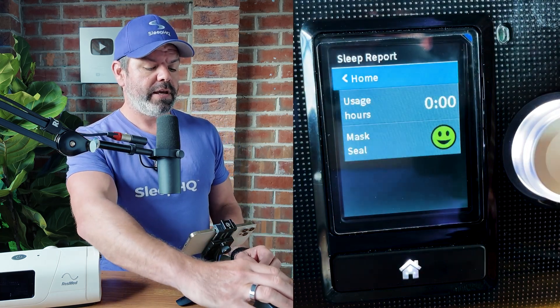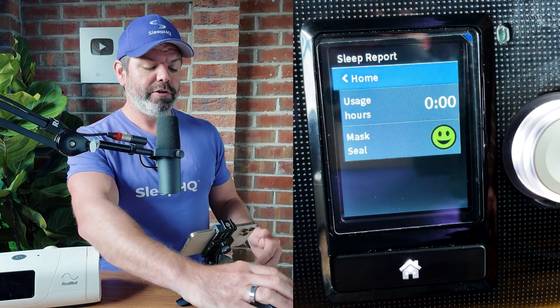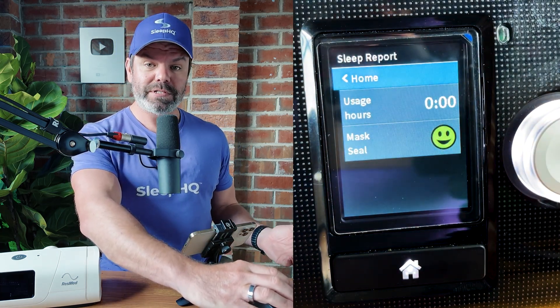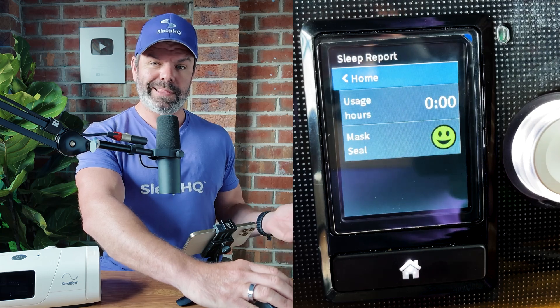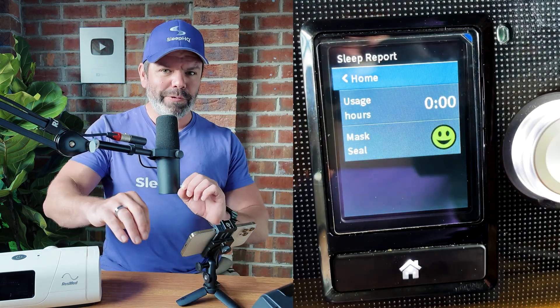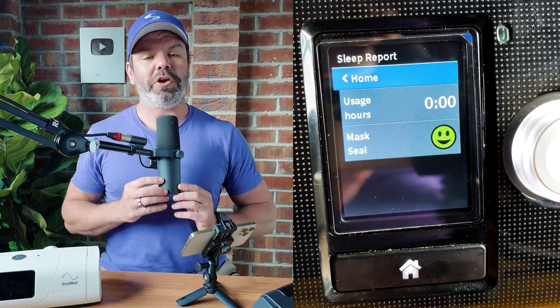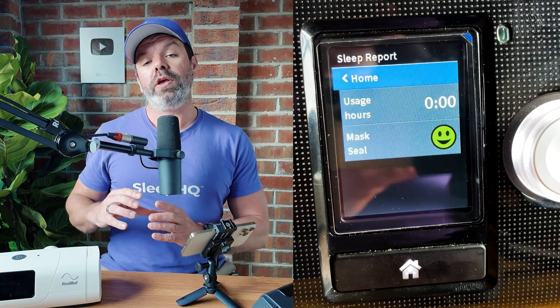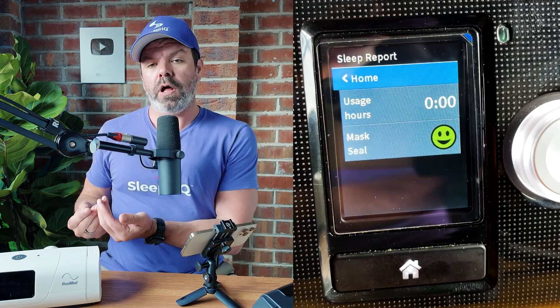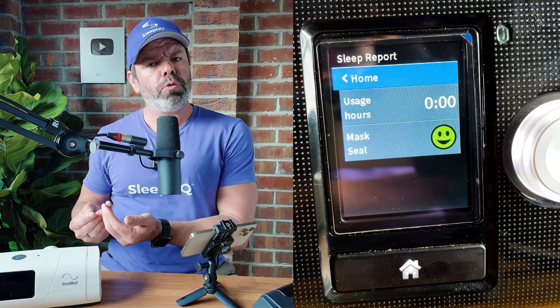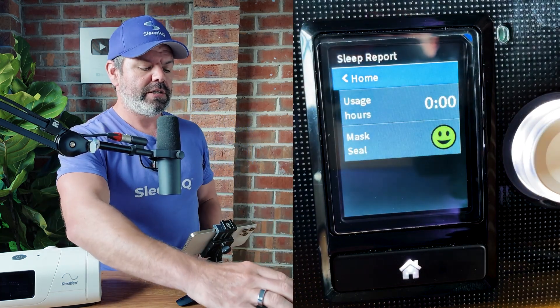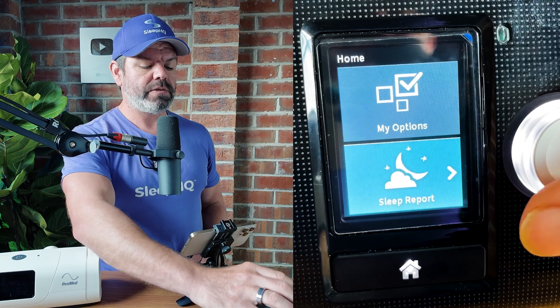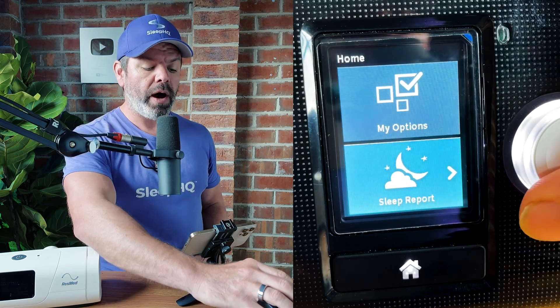Here it is — we have usage hours and mask. That's it. However, there's a secret little menu which I'll show you now where you can enable more advanced CPAP therapy information.